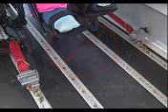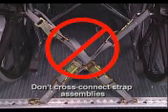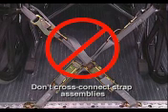Use 2 identical straps for the front and 2 identical ones for the rear. Do not cross-connect the strap assemblies. This can lead to potentially collapsing or tipping the wheelchair. If proper attachment of a specific type of chair cannot be accomplished, consult with your supervisor or contact your Sure-Lok representative.